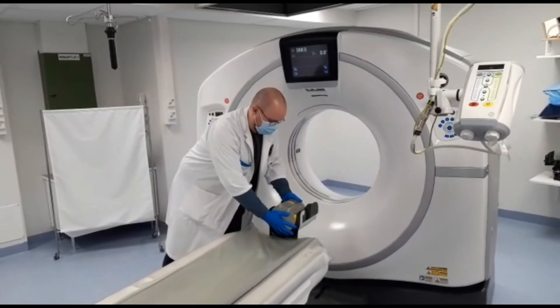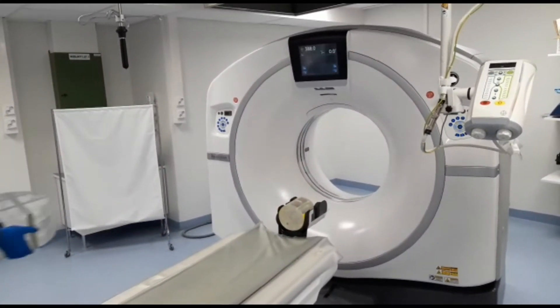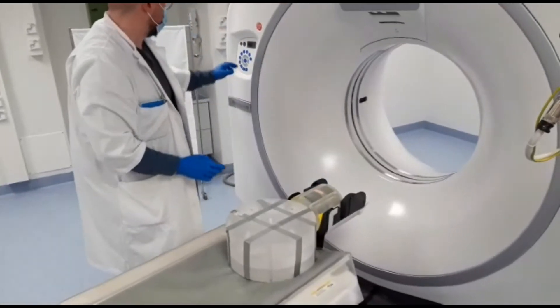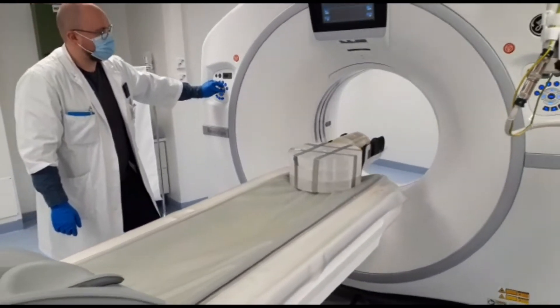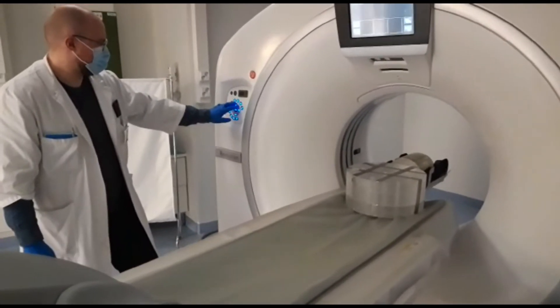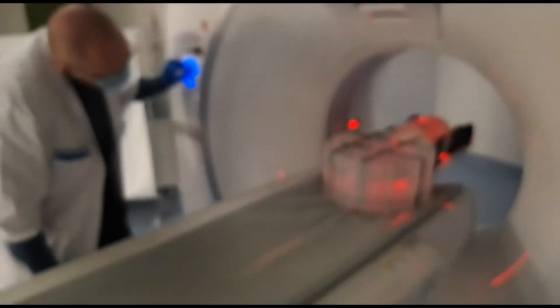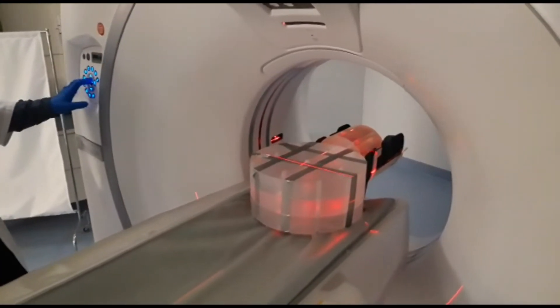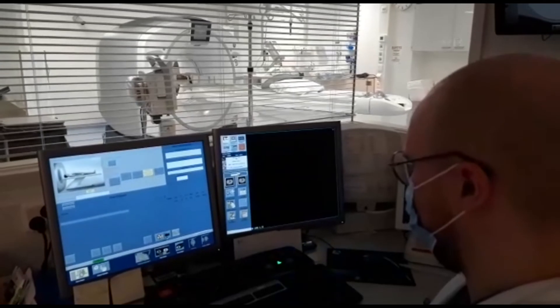Here you can see a walkthrough of the scanning process. The phantoms are placed as described in the previous slides and then centered to the center of the body phantom. At the scanner we have a preset protocol that can be used for scanning the phantoms.